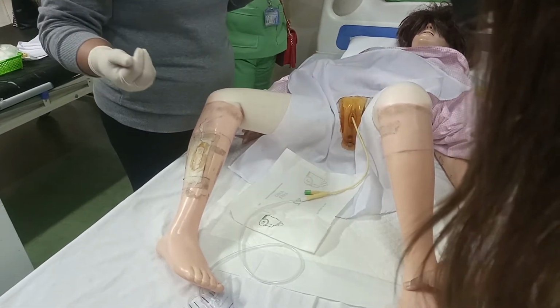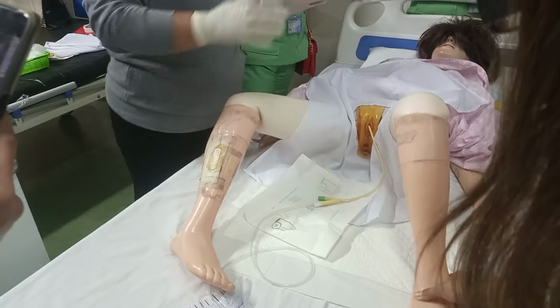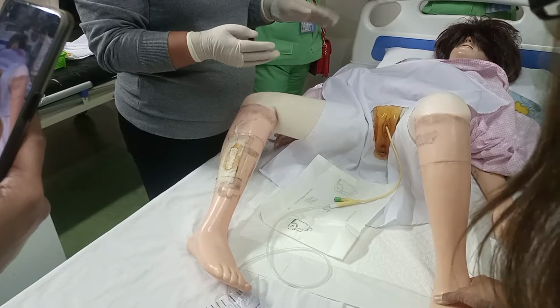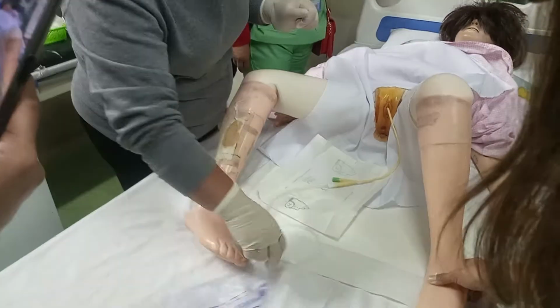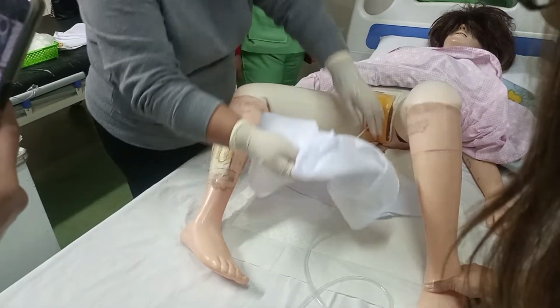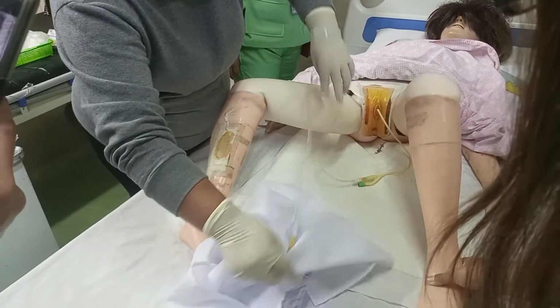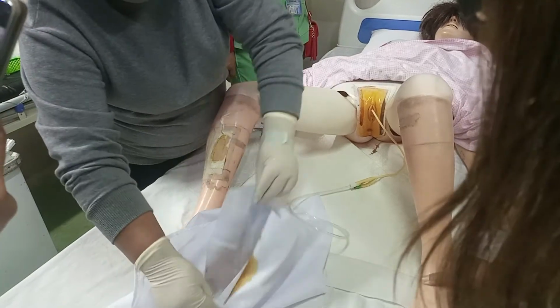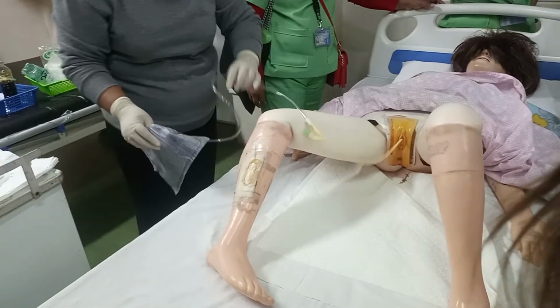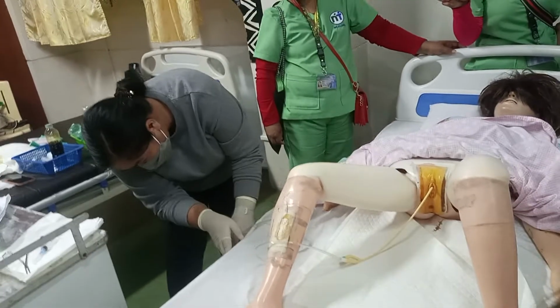Naka-anchor na yung catheter ni patient. Since naka-anchor na yung catheter ni patient, kahit hindi na ako sterile. Kasi naka-insert na ako, sure na ako. Diba? So, I can now touch other parts. I'm now going to remove this. I will remove the drape. Okay? Huwag ninyo tong masyadong tinataas, ha? Okay, so like that. Above the knee or over the knee, okay, over the legs, maghanap ka ng pag-aangkuran mo.